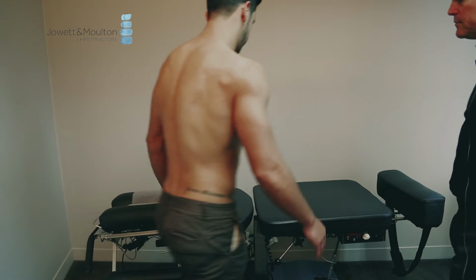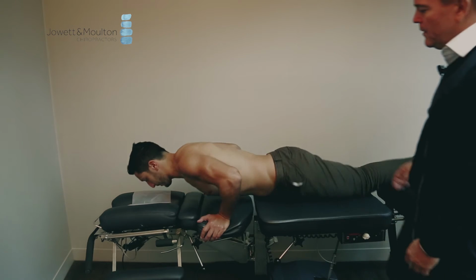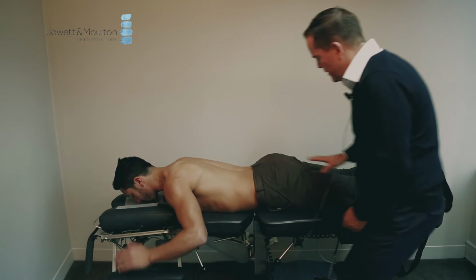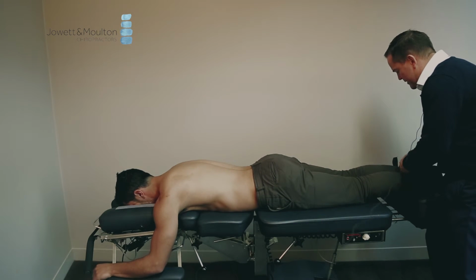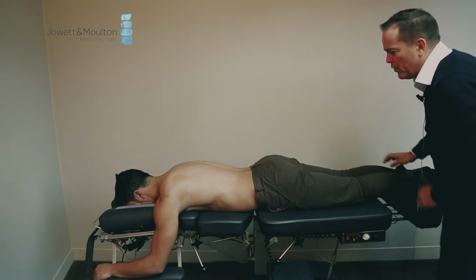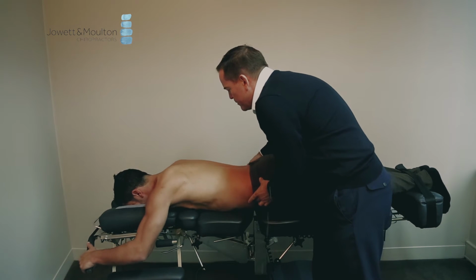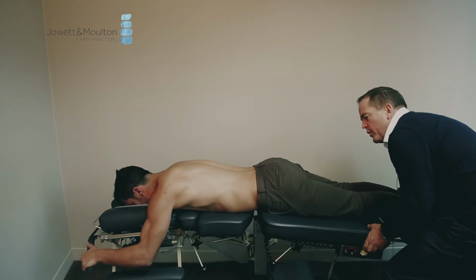We're going to get Chad up on the table. So we want Chad midway on the table there. We're going to tie his feet in so that we can traction him down. And Chad, we want you to hold on up the top here and just shuffle yourself up a little bit. I'm going to increase the stretch a little bit, lowering the table.